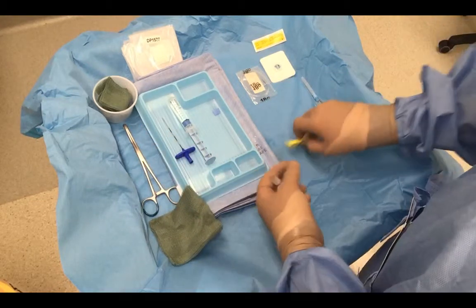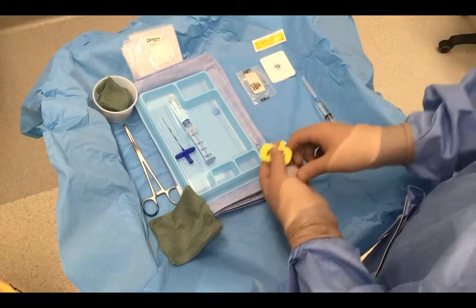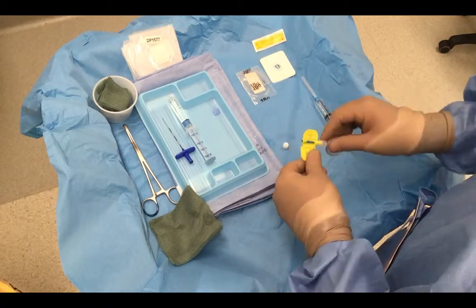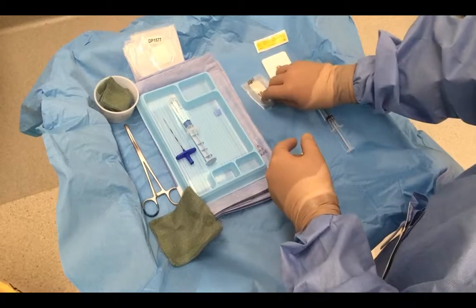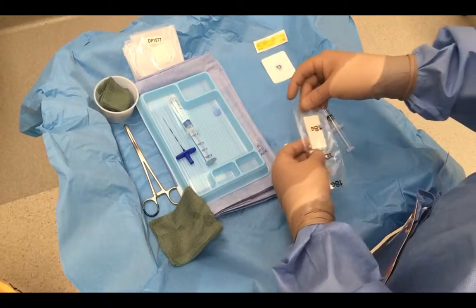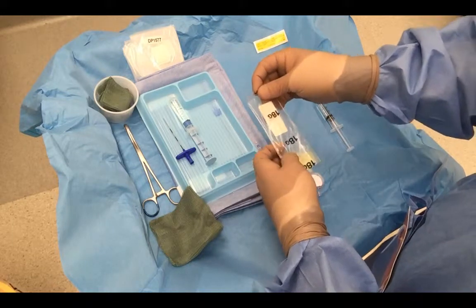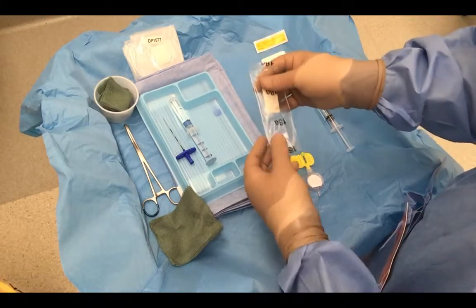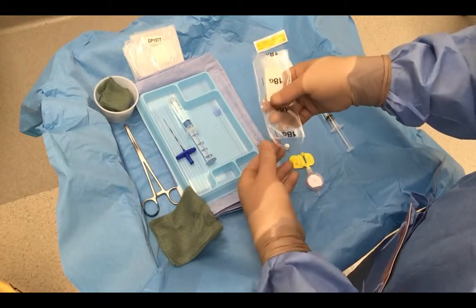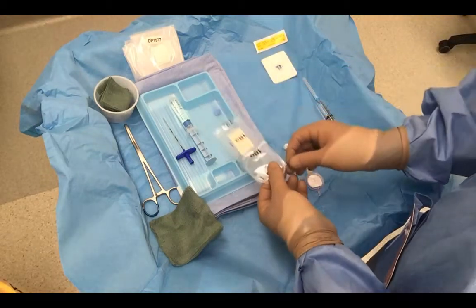Alright, we're going to put our kit together. What we'd like to do to minimise the introduction of air into the epidural space is to flush our catheter. There is a way of doing this so as not to contaminate, even though we've got sterile gloves on. Just by rotating gently, we're going to get the end of this catheter out there.